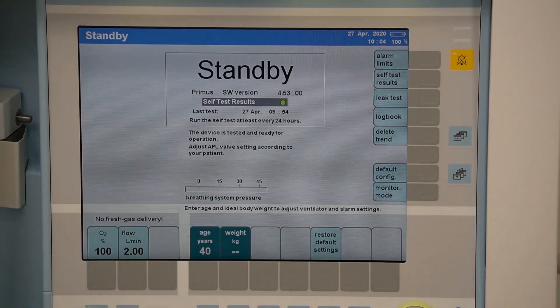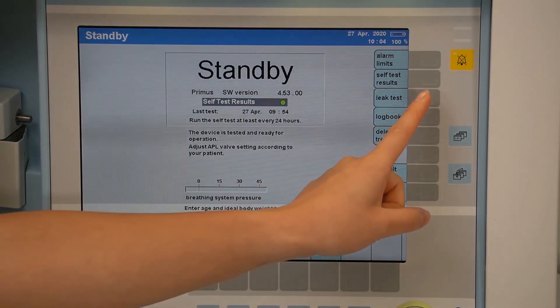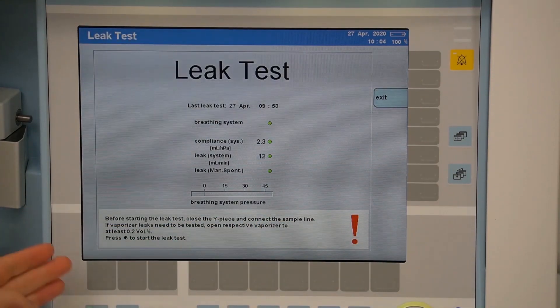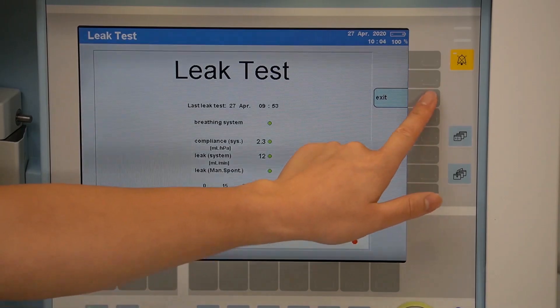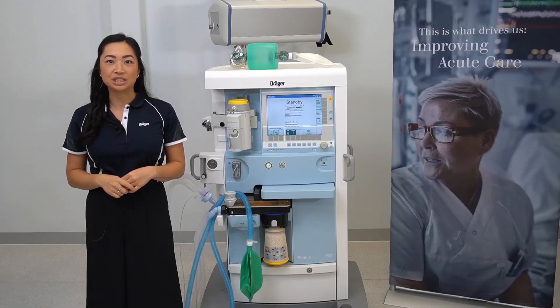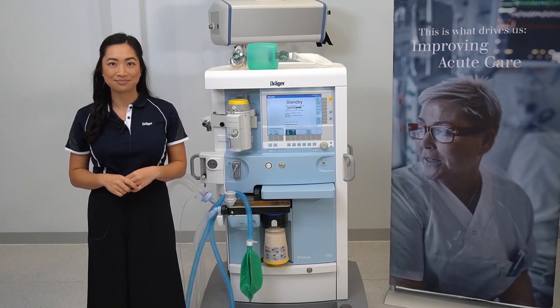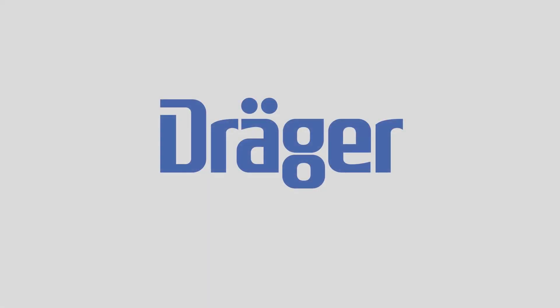To exit back to the main screen, press exit. To access the leak test, this is located from the main screen on the side. A leak test should be completed every time the breathing system is added to or modified — it takes about two to three minutes to complete. For further information, please refer to the instructions for use or contact your local Dräger representative.